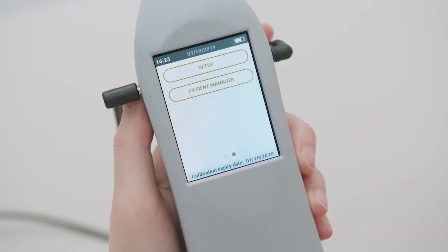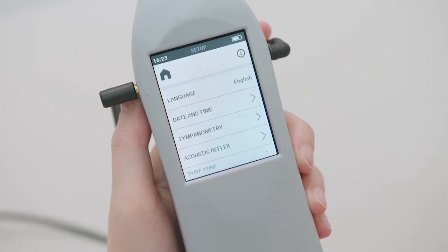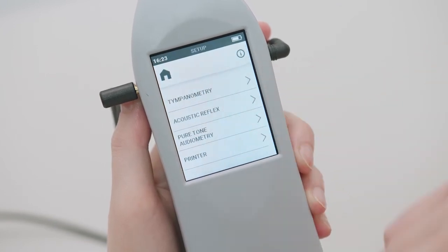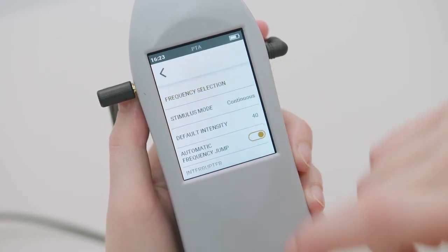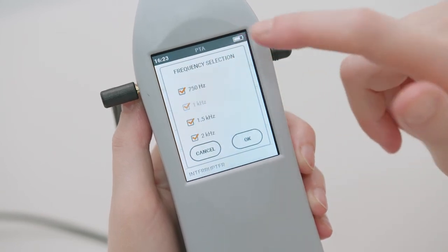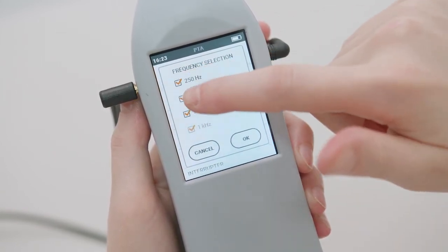The audiometric exam settings menu allows you to customize several parameters. Let's see what we can do here. It is possible to select the frequencies individually. Stimulus frequencies are available between 125 Hertz to 8 kilohertz.